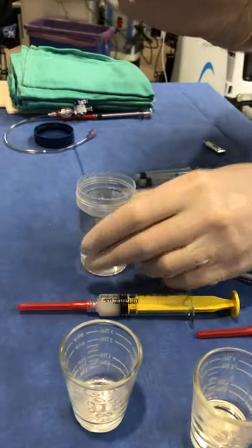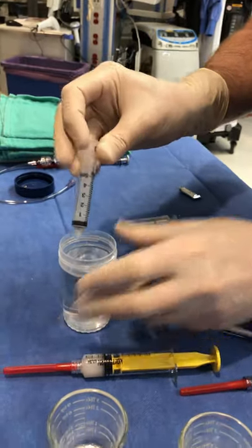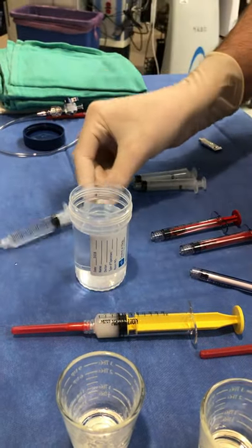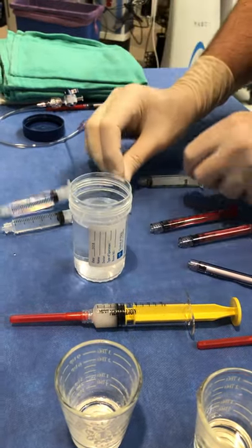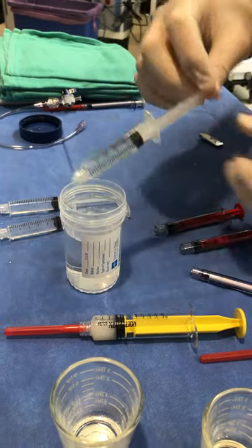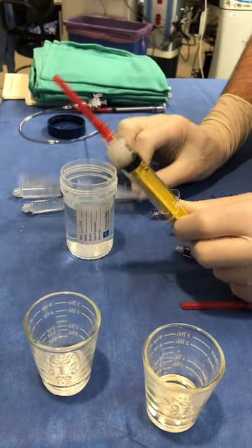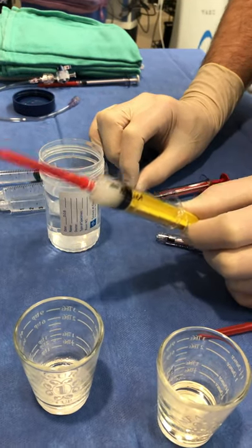Next, we use five cc syringes — these are just regular syringes, non-polycarbonate. This is pure D5, and we remember that D5 goes in the fives — easy way to remember. We label these afterwards as well, and usually make three. D5 is used to flush the catheter and needle before and after injection, because the glue will harden in anything other than D5 — any kind of free ion, blood, saline, anything other than D5.